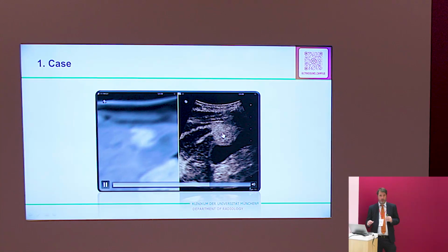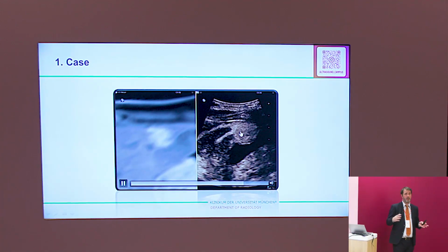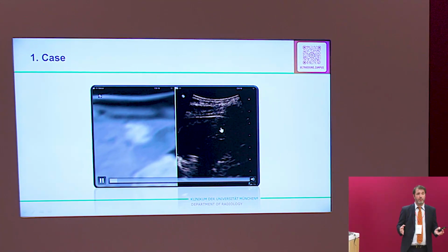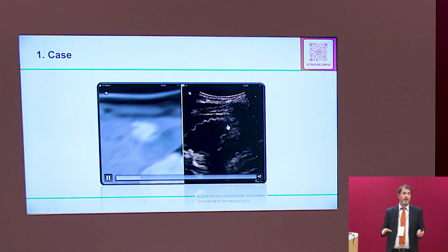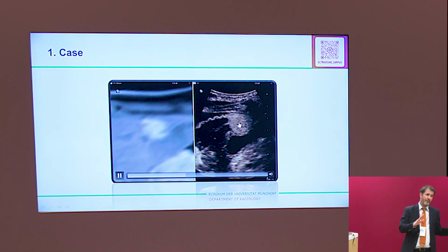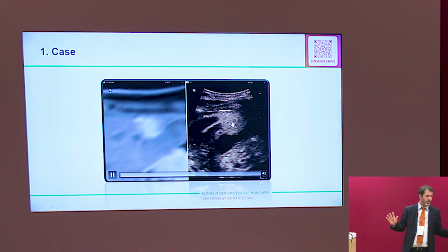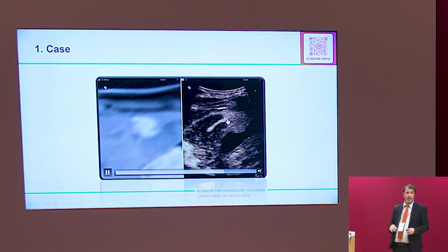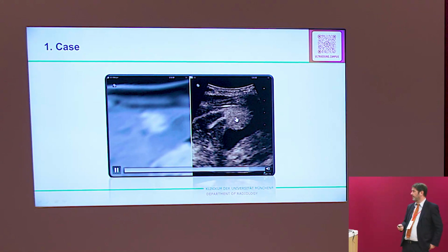This lesion shows strong uptake from the center to the periphery. And due to the fact that this lesion has no washout later, we know exactly, we could confirm the diagnosis of the MRI. It's just an FNH. Sometimes even a benign lesion can compress something, but there is no risk of cancer in this case.